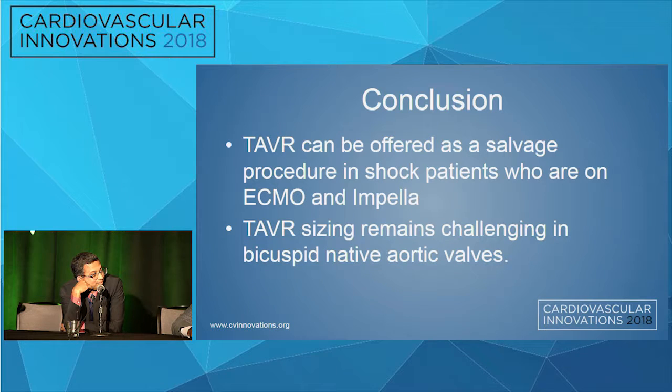Just to defend this, we get this all the time, is that you're on ECMO, but that arterial cannula is coming with pretty big force. So if you have AI and you worsen the AI, I don't think the ECMO is going to really help that much. No, the ventricle will blow up. So I think I'm just defending the decision. Just go ahead and get the valve in. I mean, that was a good way.